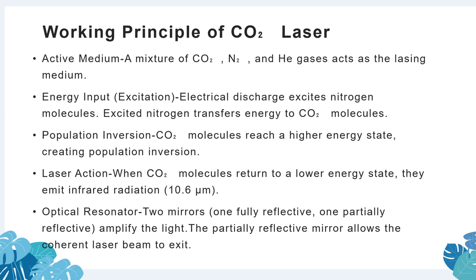For energy input, this is the excitation. The electrical discharge excites nitrogen molecules, and the excited nitrogen transfers energy to CO2 molecules. Then the inversion process: the CO2 molecules reach a higher energy state, creating a population inversion. Only after reaching the higher energy state can it create an inversion. If it does not go to a higher energy state and is maintained in a moderate state itself, then there will not be an inversion. That will remain in excitation itself only. Okay, then we will move to the laser action.